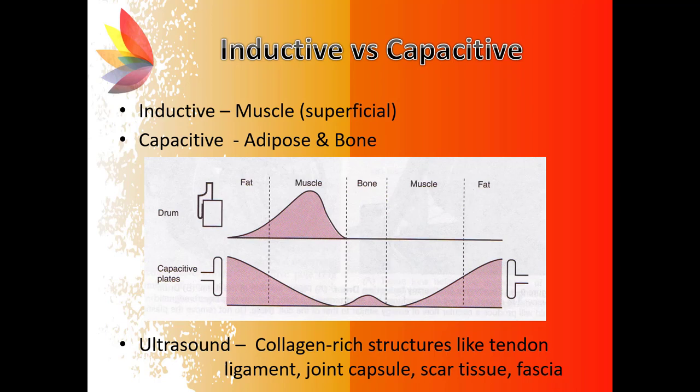The amount of heat produced depends upon the strength of the electromagnetic field and the distance between the tissues and the source. As the distance between the source of the electromagnetic field and the tissues increases, the strength of the field decreases by the square of the distance.